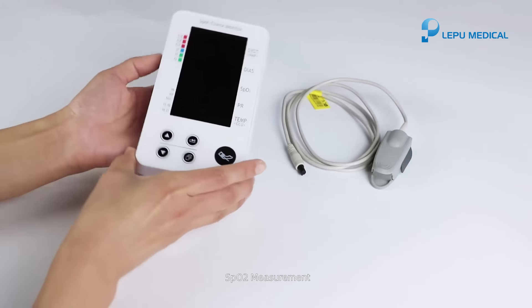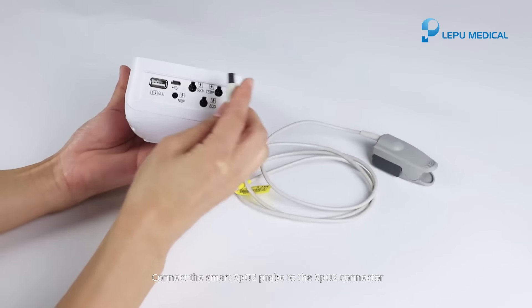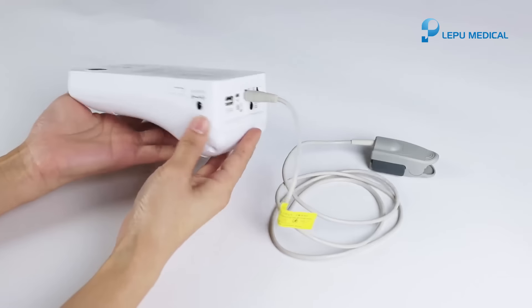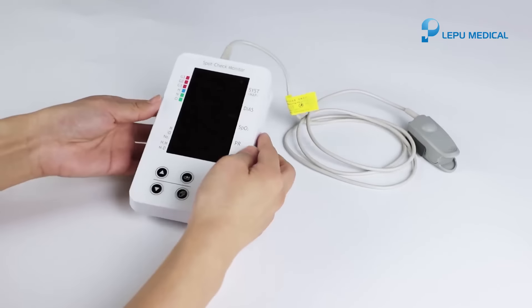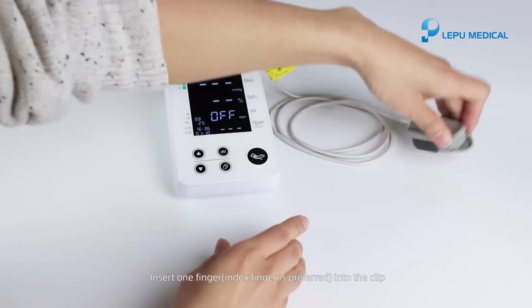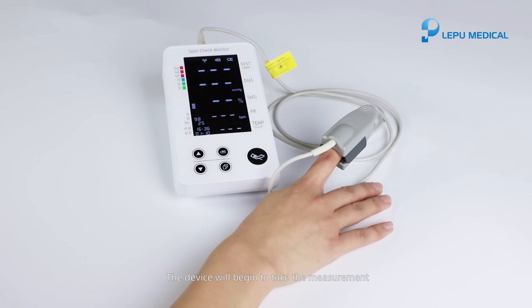SPO2 measurement. Connect the smart SPO2 probe to the SPO2 connector. Press the power button to turn on the machine. Insert one finger — index finger is preferred — into the clip. The device will begin to take the measurement.